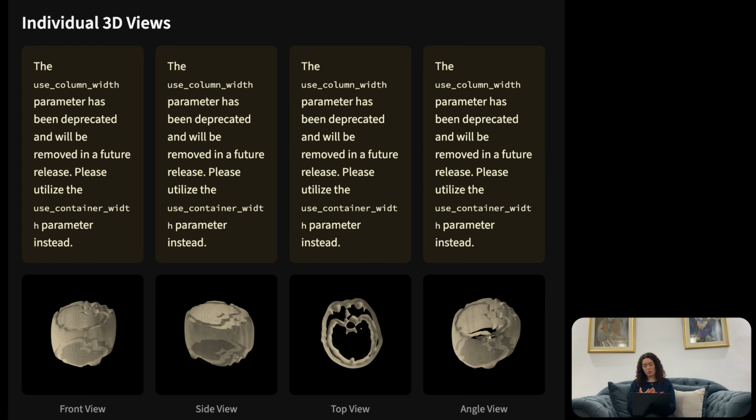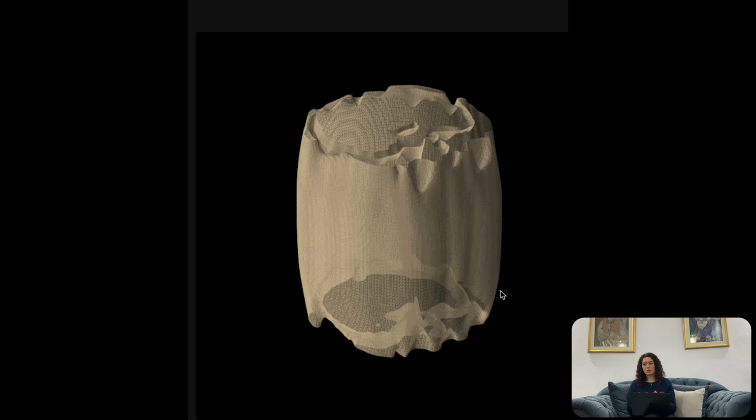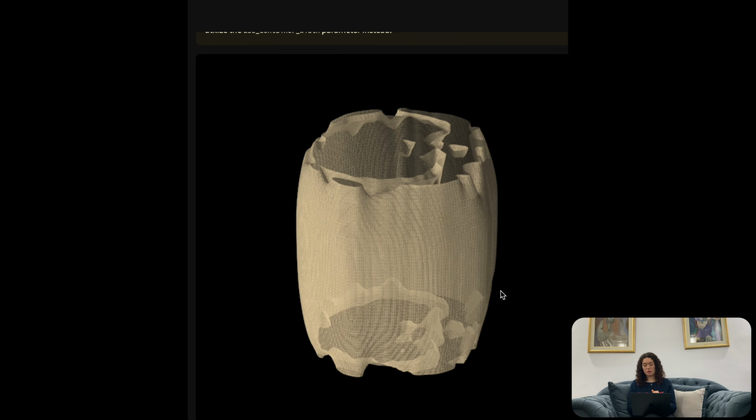In parallel, I plan to extend explainability using LLMs. I will have to use the server for this, which is why I couldn't do it the past few weeks. It's to convert the Grad-CAM results and the model predictions into a really thorough explanation, because what I have now is auto-generated and very limited.